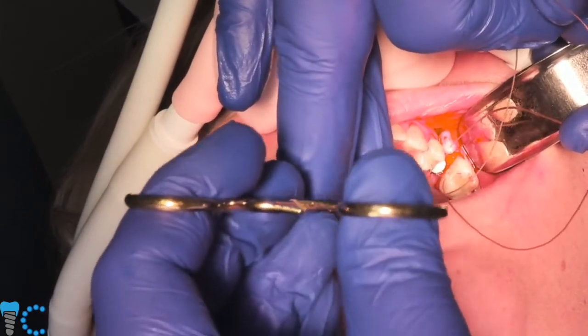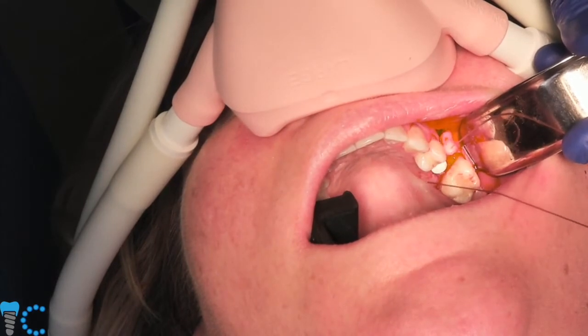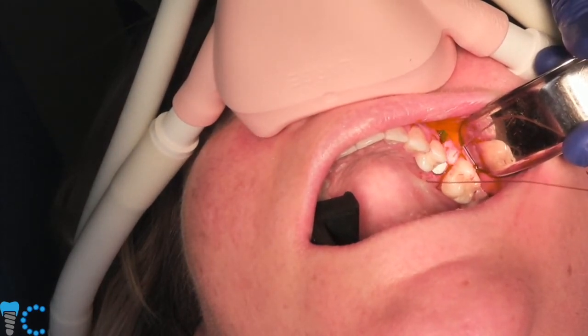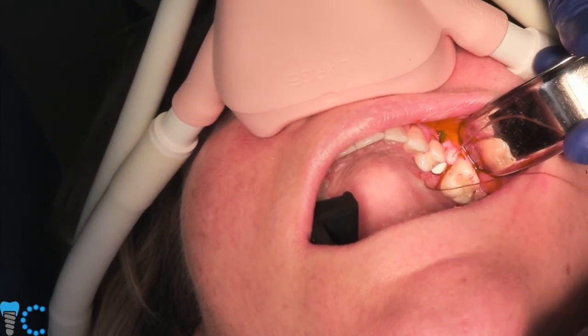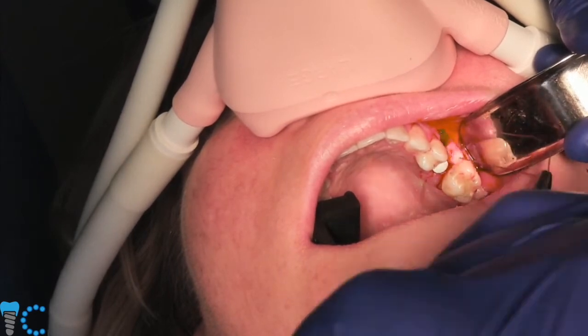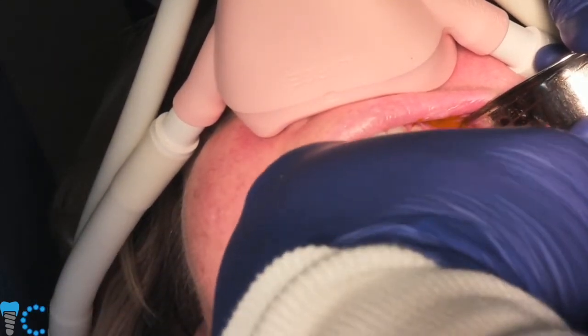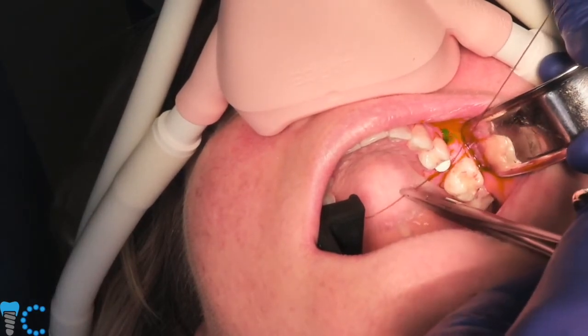What suture are you using here? We're using 3/0 chromic gut, which is a resorbable, and it'll be here for about a week. And when we see a patient a week or two post-op, sometimes these sutures are still there, sometimes they're not. If they're not, that's perfectly good. It's partly why we use them, because we're lazy.